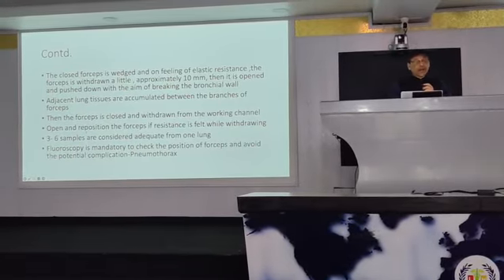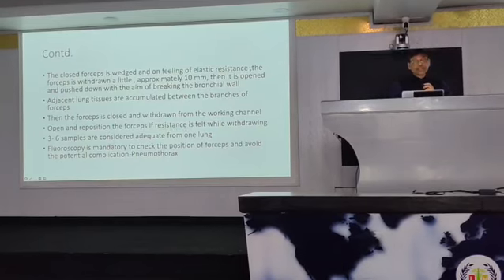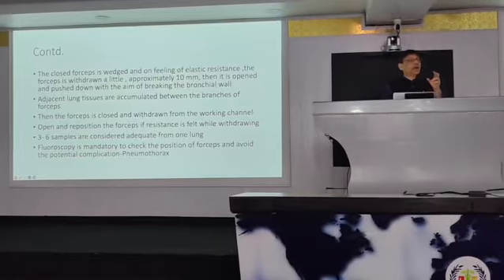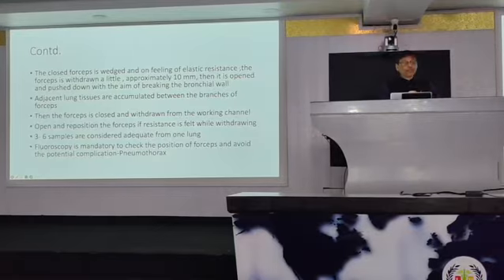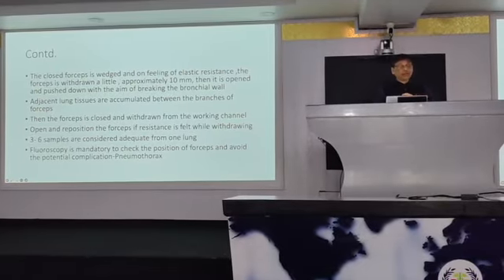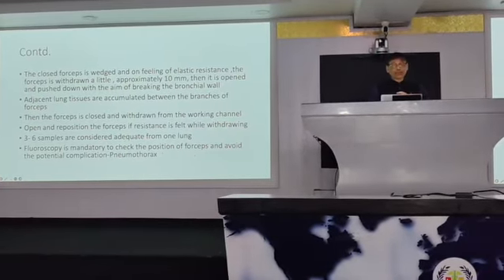Open and reposition the forceps if resistance is felt while withdrawing. So while withdrawing, if resistance is felt, then open and reposition the forceps. Three to six samples are considered adequate from one lung. Fluoroscopy is mandatory to check the position of forceps.